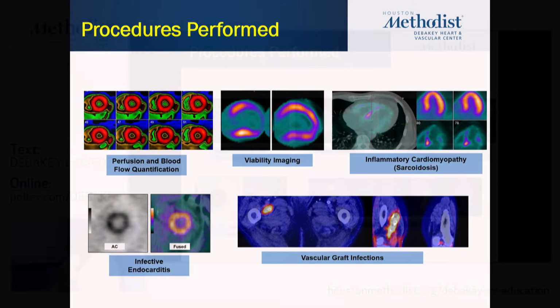We have a big cardiac sarcoma practice here at the hospital. Is there a role for PET CT in those patients, benign versus malignant? Benign versus malignant is very helpful, PET in general, not only in cardiac but in other malignancies or tumors in general.